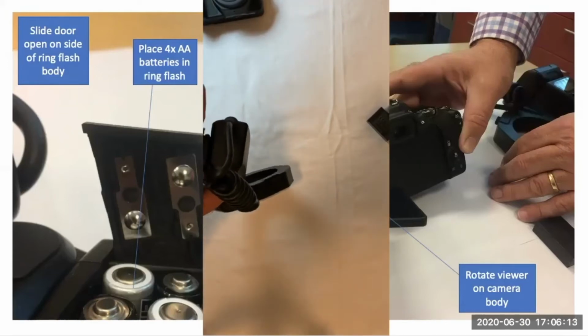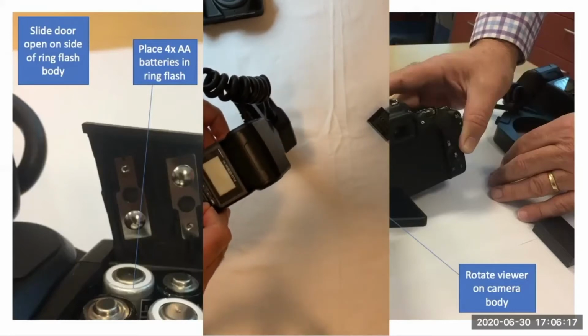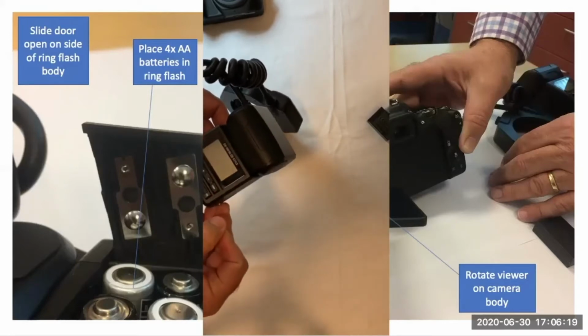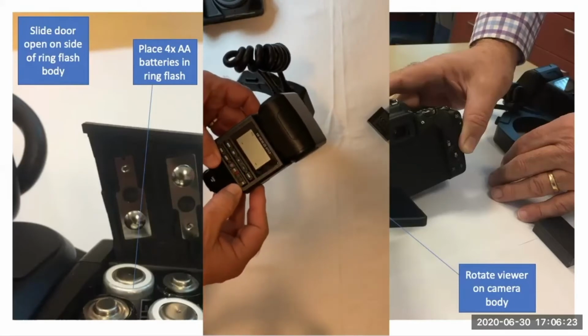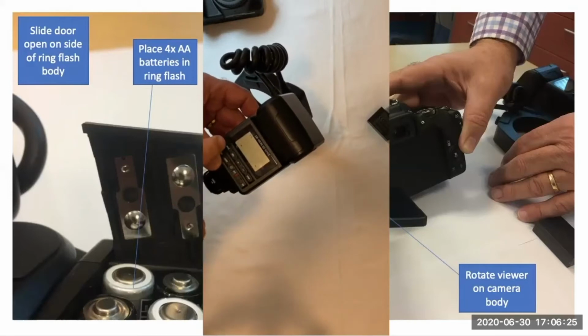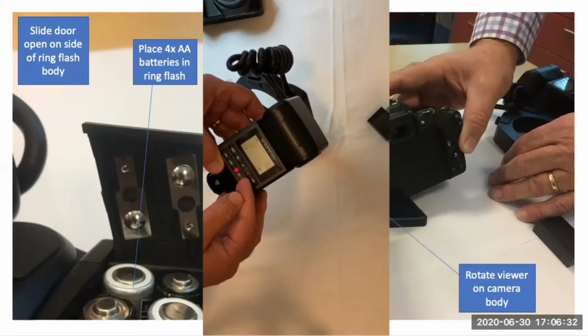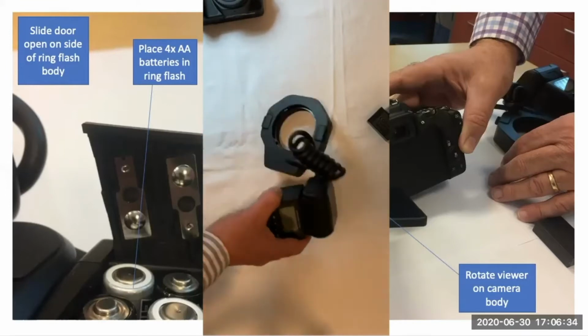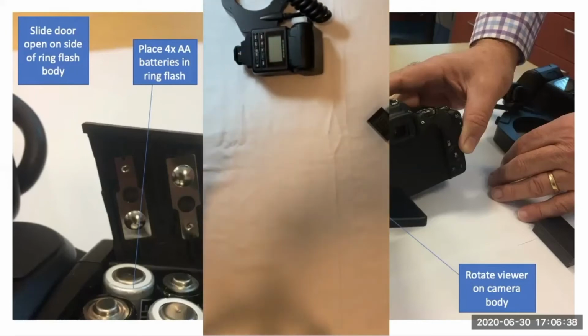It's probably a good idea to get ones that you can reuse and recharge. Check and make sure it makes a noise, which it does. And you've got a battery, and you probably should just leave that at TTL. But we'll come back to having that set up, which is through the lens metering, later on. So it's good. We've got power inside the ring flash.